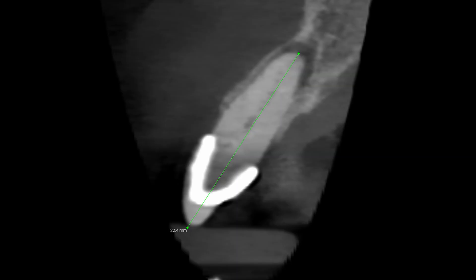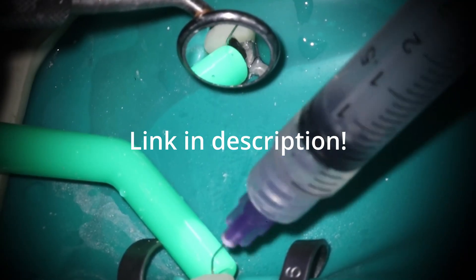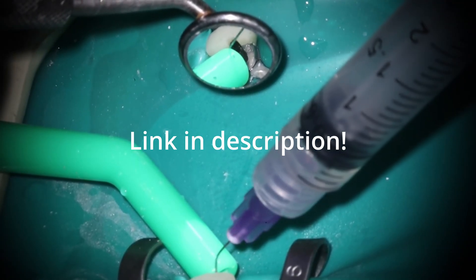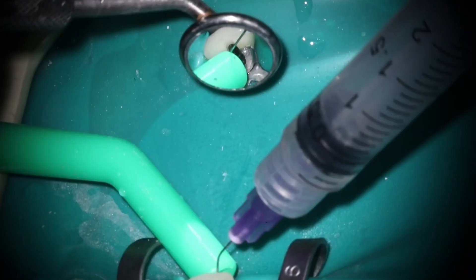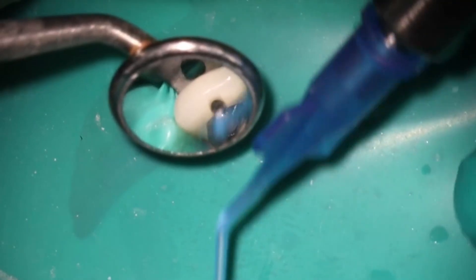Look at how the canal itself shows you where to access — right along the long axis. You'll notice this especially with premolars. If you've watched my video on accessing teeth, I talked about this a lot, but it's really important to use the cone beam to map out what you're going to get into before you even do the root canal.